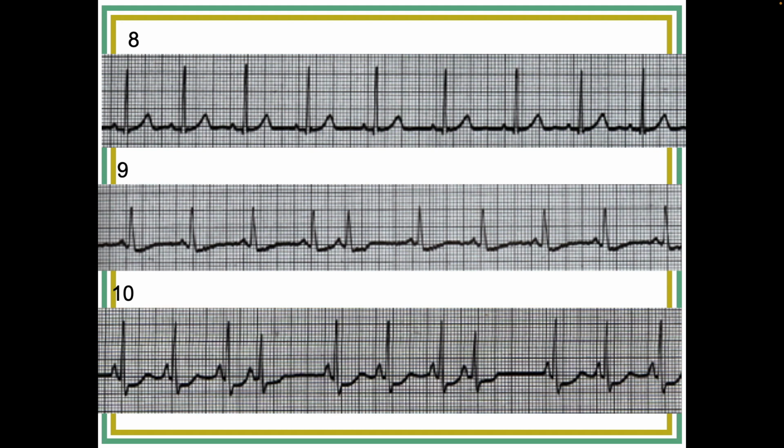So you're going to see that over and over again, and that's a useful part of learning ECGs, is to get a repertoire of shapes in your head, a repertoire of patterns. And a very useful pattern is when you see a short R to R interval followed by a long R to R interval. Suspect, it's not always, but suspect a premature beat.